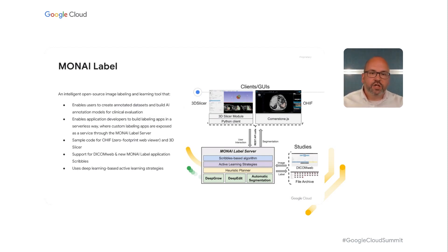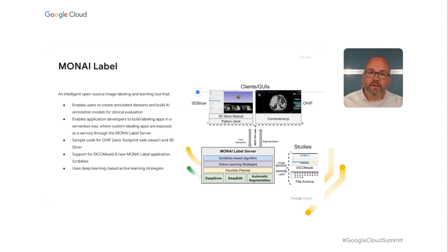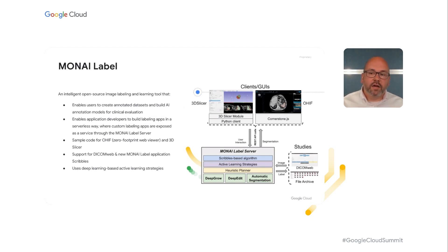MONAI Label ships annotation results back to the viewer for rendering. It even has an active learning component and gets smarter over time, so as we annotate imaging studies the accuracy keeps improving. All of this, connected with our medical imaging viewers, helps enable radiologists and clinicians as part of their annotation process.